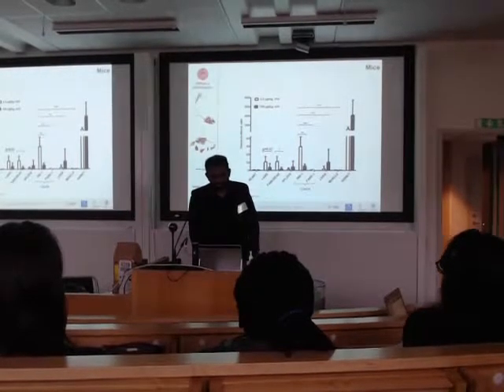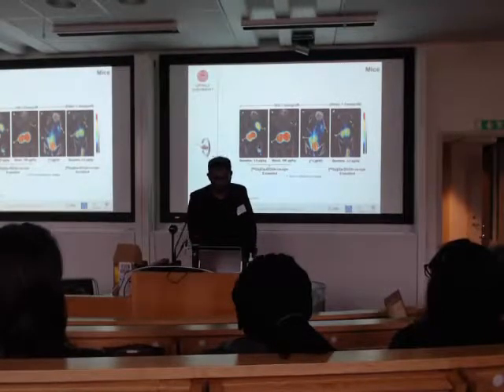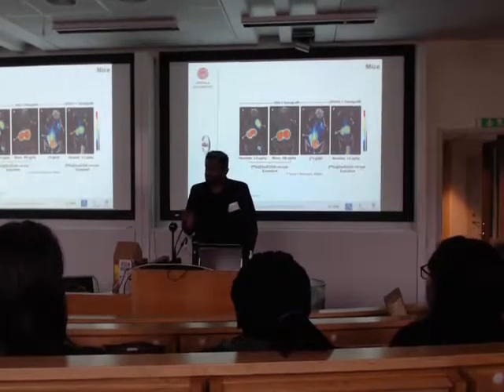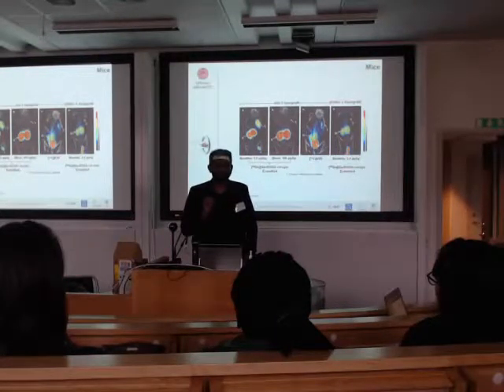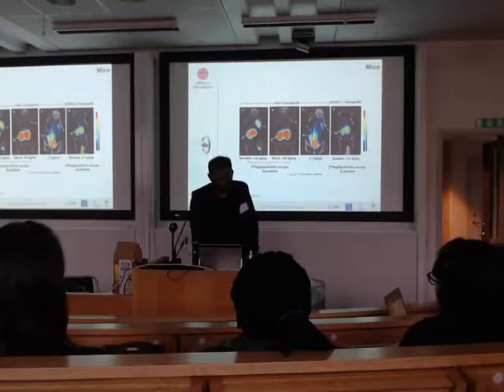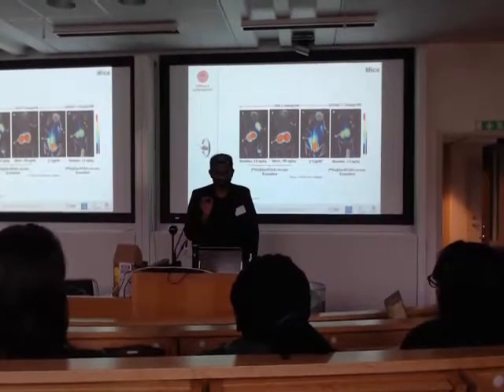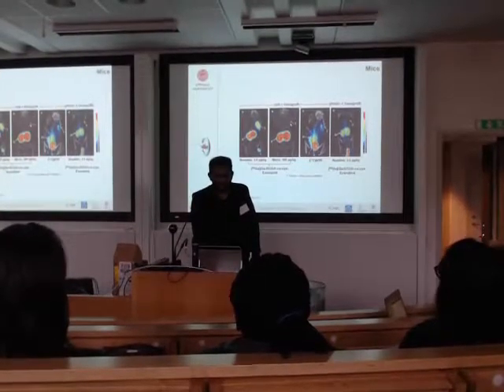Then we try to image these tumor models. This is the baseline study on an insulinoma tumor model. As you can see, this tracer is excreted through the kidneys. Unfortunately, the pancreas is very close to the kidneys, and because of what we call the partial volume effect, you cannot visualize the pancreas in small animal models. But in the insulinoma tumor model, you can clearly see quite high uptake of the tracer, and we were able to block it.